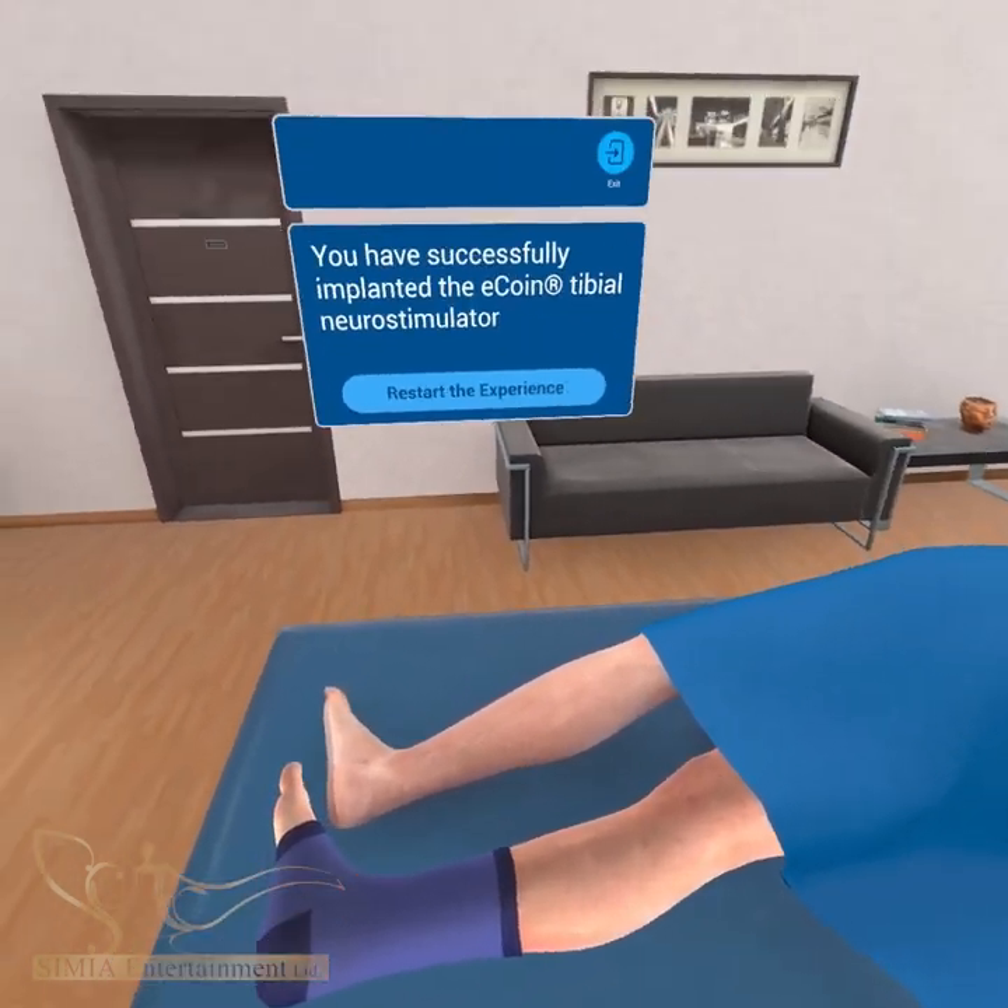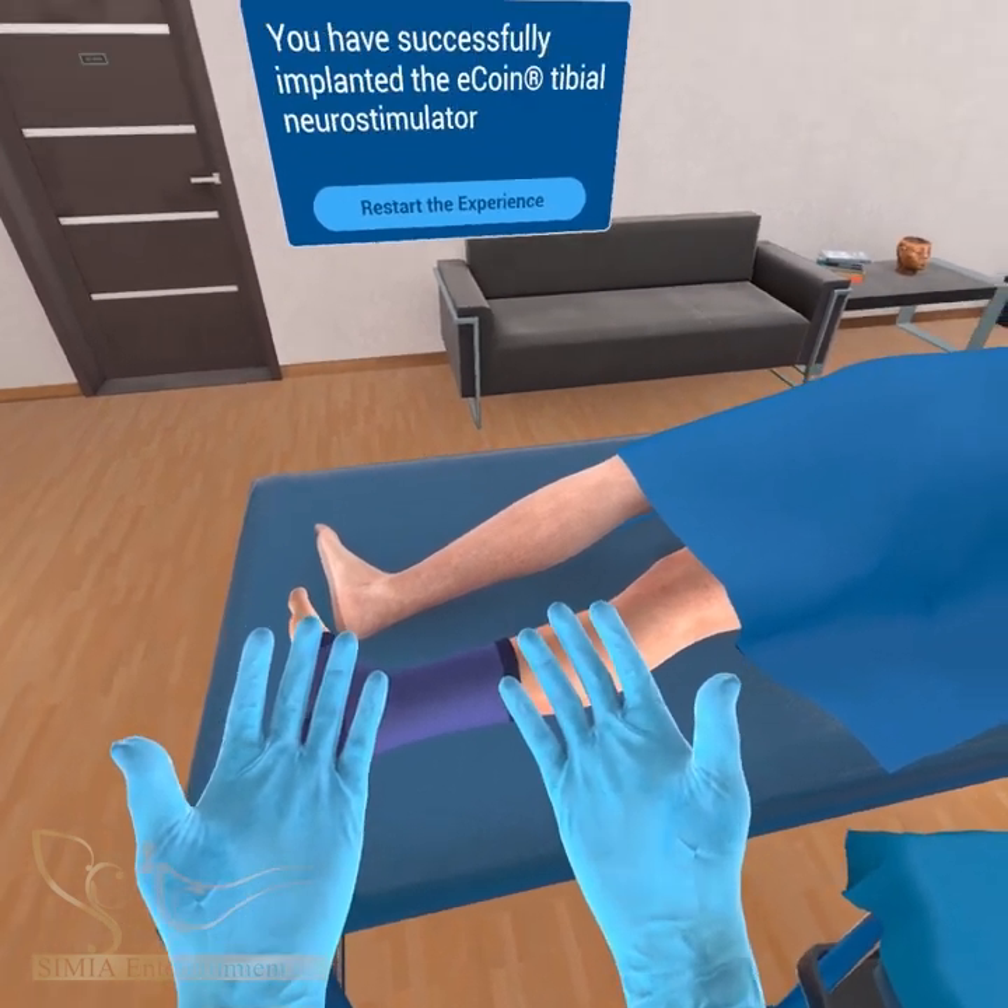Congratulations! You have successfully implanted the ECOIN tibial stimulator.